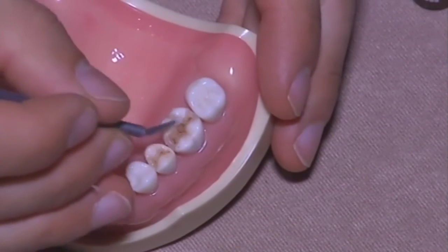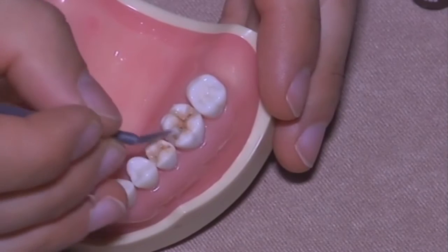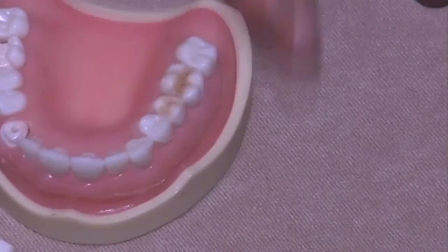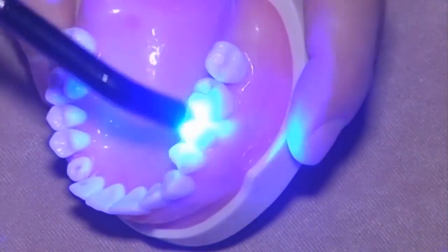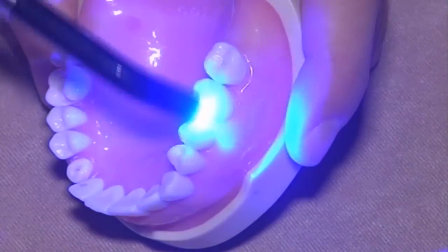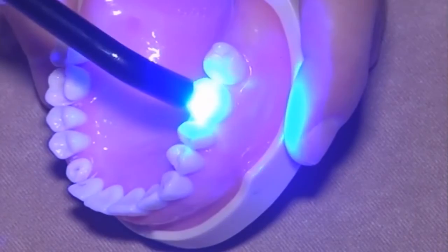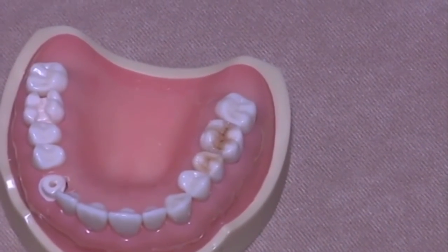As last layer, because this is the last layer, now we just miss to light cure for the last time, and then remember the OxyGuard, so the glycerin gel, to avoid the dispersed phase of the composite, which is the oxygen inhibited layer. And then we move to the finishing procedure.